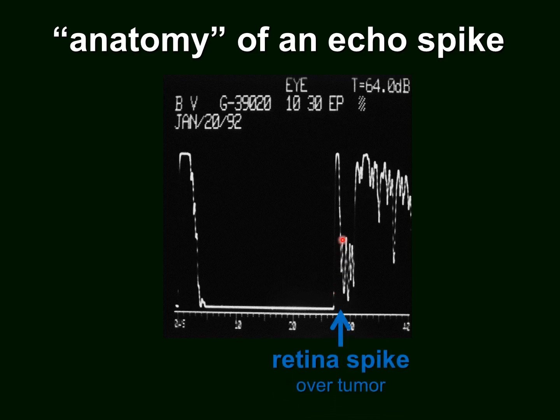Here we have the retina. It's a smooth surface, and when we maximize the signal, then this spike rises from the baseline up to the peak very suddenly, a thin, smooth line, interrupted here only by two high-frequency nodules, remnants of the high-frequency oscillations that were filtered out.